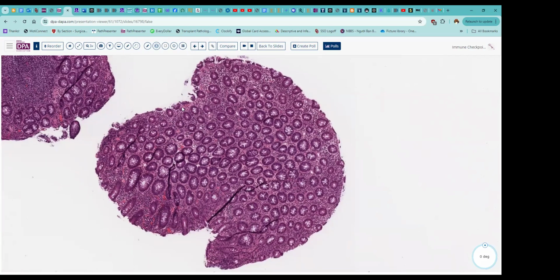But I think more typically, this microscopic colitis type of pattern is what you should expect to see in those patients. And they're usually picked up because after they begin the drug, they begin to have intestinal symptoms, maybe some diarrhea, maybe some cramping, maybe a little blood, those sorts of changes.